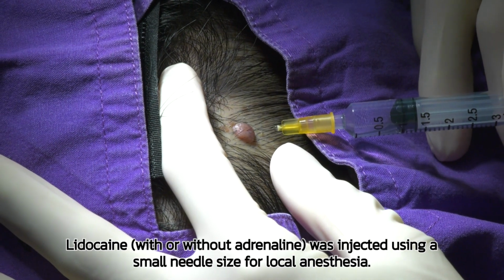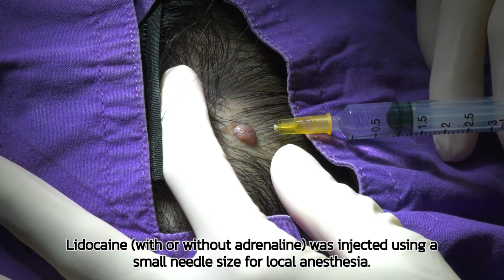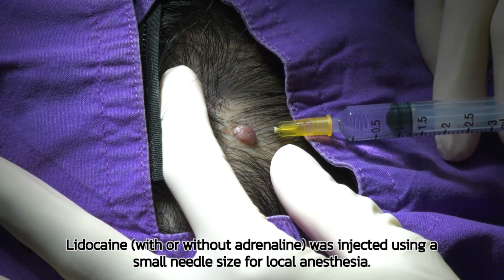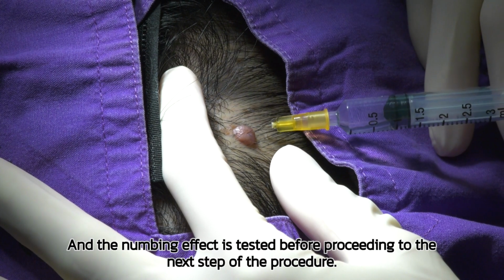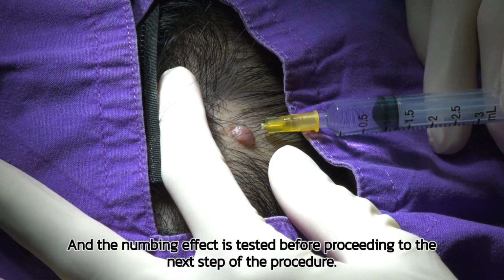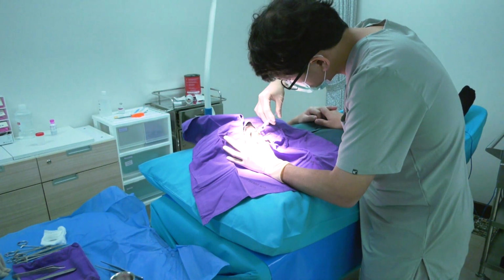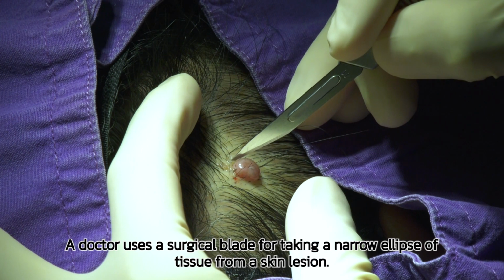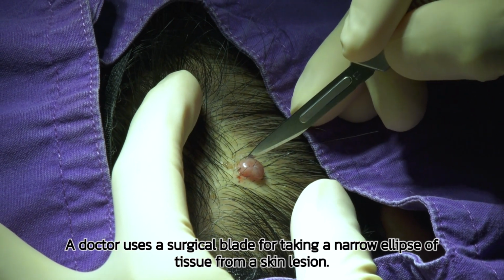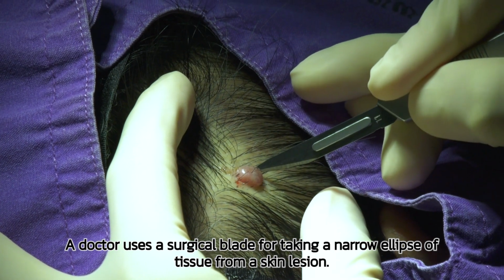Lidocaine, with or without adrenaline, is injected using a small needle size for local anesthesia, and the numbing effect is tested before proceeding to the next step of the procedure. A doctor uses a surgical blade for taking a narrow ellipse of tissue from a skin lesion.